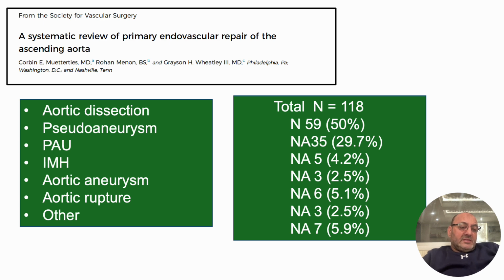For aortic rupture, an ascending graft could be a really life-saving procedure for these patients, because you save their life and then you can fight another day. When you have a rupture, a really dramatic, life-threatening condition, your goal is to save the patient's life, not to do the perfect operation. You're in, you save their life, you stop the bleeding, and you're out. They get better, you fight another day. And that's a perfect solution for a condition like that.